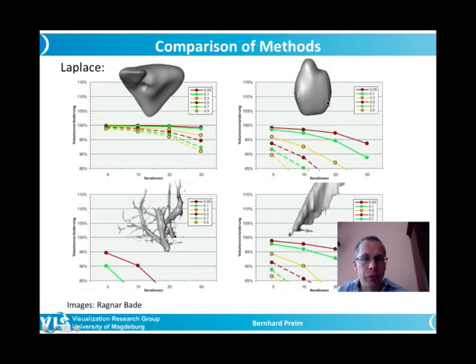Yeah, and you see with the lymph node it goes down very fast, yeah, to a region where the volume really is preserved very badly. Yeah, the same happens to the vascular tree and also to this muscle. Only for a large compact structure that can be neglected.